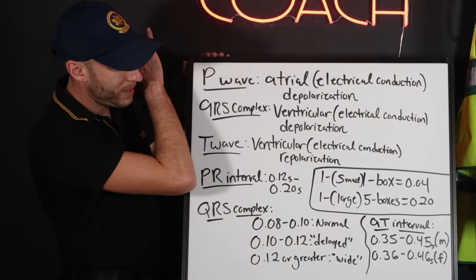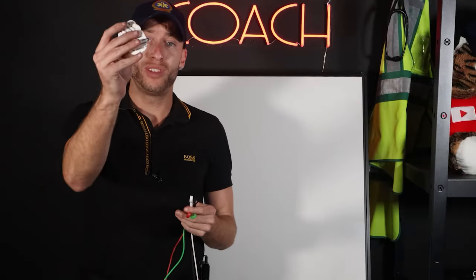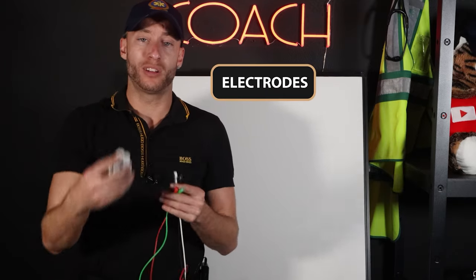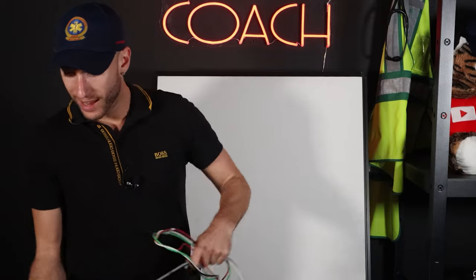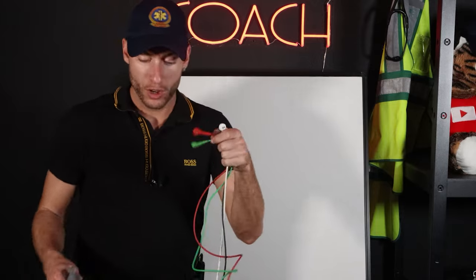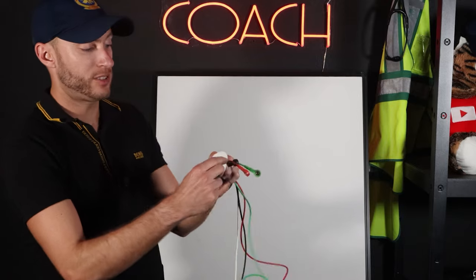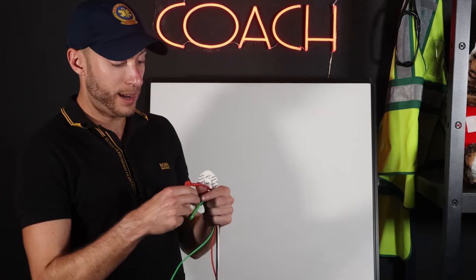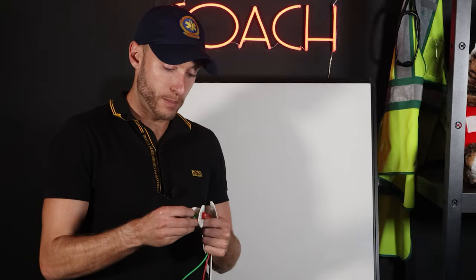Now I have the actual EKG wires here. These are the electrodes we're going to stick on the patient. This end connects into the LifePak, and this end goes on the patient. I'll take an electrode and it snaps right in — you can see it just snaps. So I'll snap these in, and then I'll give you a mnemonic to remember lead placement for the rest of your career.